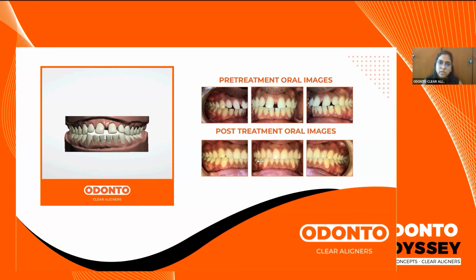After proximal stripping, is it necessary for fluoride application? Not always. If your patient is prone to caries lesions or already has multiple caries lesions, then in some cases you can opt for a desensitizing toothpaste to be prescribed. Fluoride application is not 100% necessary. If the patient has good oral hygiene, then it's not absolutely necessary.